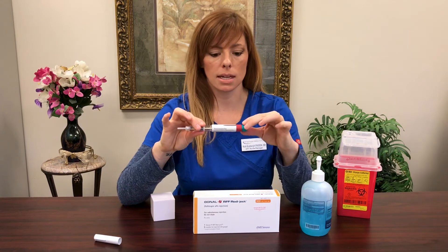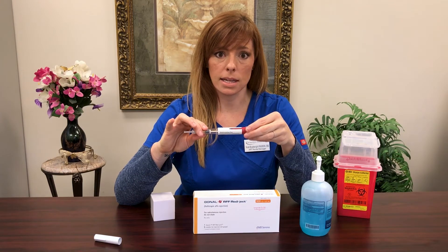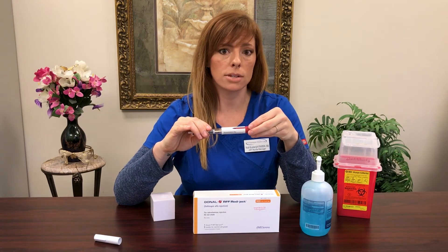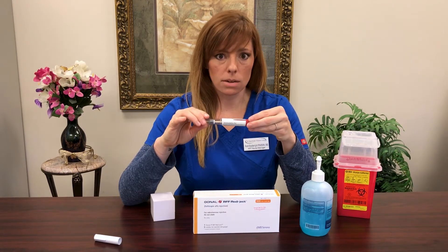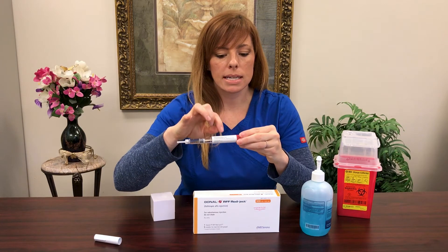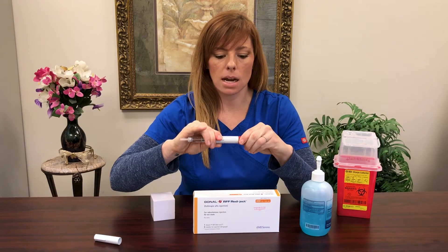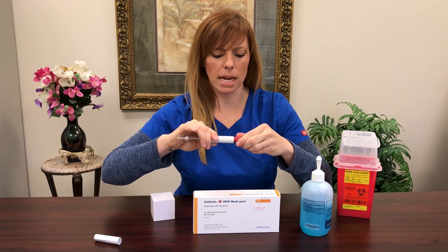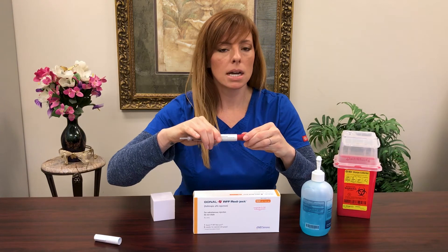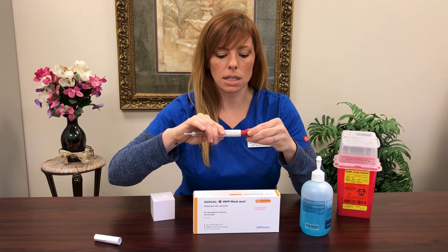The next thing we're going to do is set our dosing. Dosing can vary from 75 units daily all the way up to 450 units daily. You might even have a doctor prescribe dosing twice daily — for example, 225 units twice daily — and that's absolutely okay. When you're dialing up your pen, all you do is twist the pen and you'll see a number in a little window — that's your dosing number. Continue to twist until you find the number your nurse has told you to select for the day. If you dial past your dosing number, you can just dial it right back down. Today I'm going with 300, so we'll go ahead and select 300.